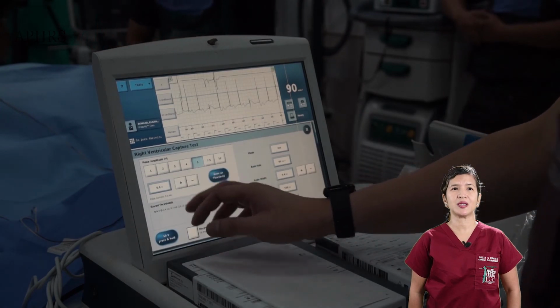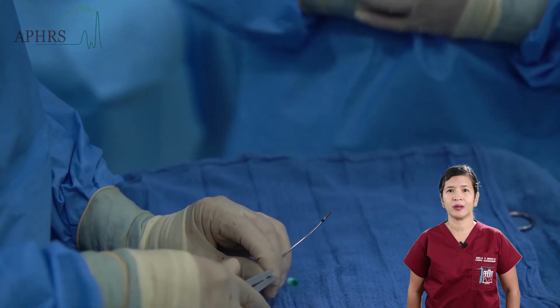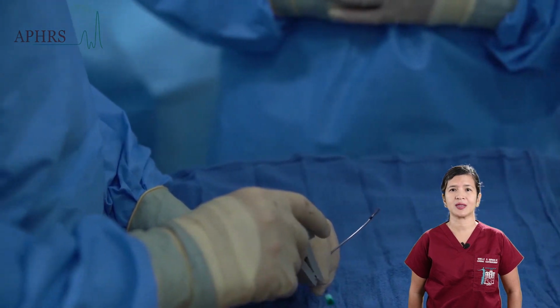High output pacing is performed by pacing at 10 volts to ensure that there is no diaphragmatic stimulation.